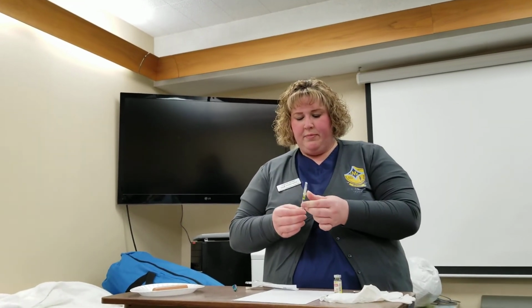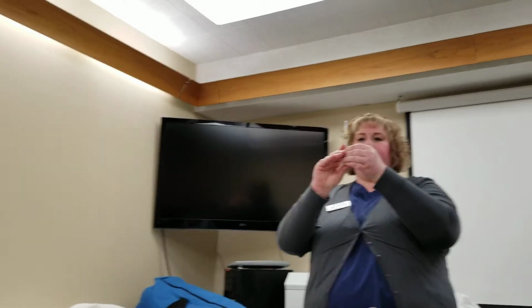Once I have it, I'm going to use the scoop method to recap my syringe, and I'm going to ensure that I have the correct amount of medication. Now I'm ready to see my patient.